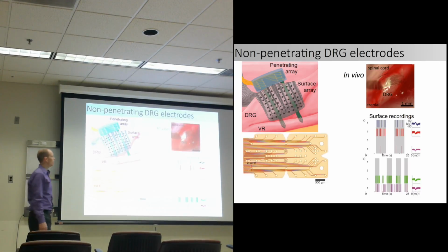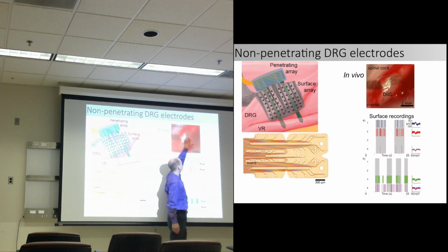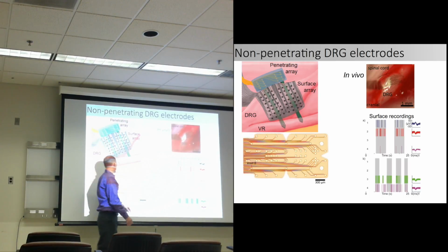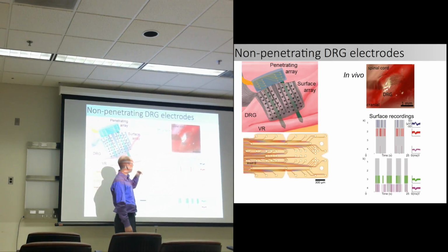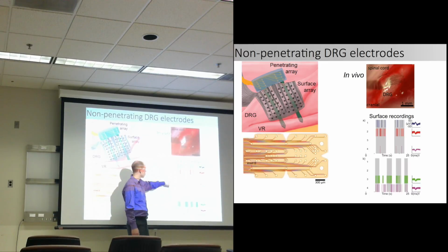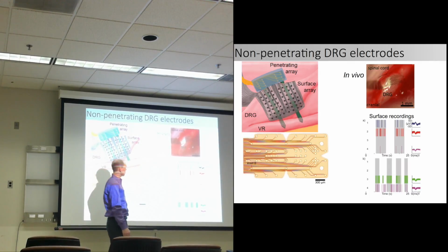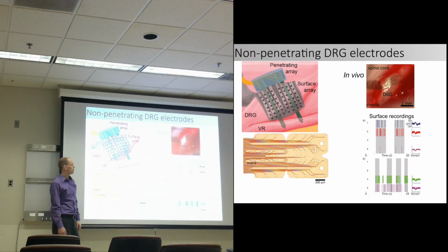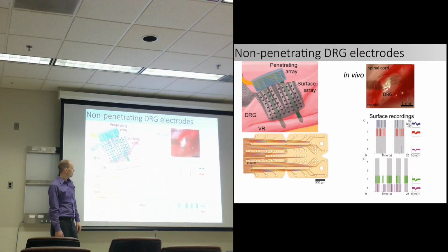So I tested this out in one experiment so far, and this is part of the electrode here. You almost see the 3x3 grid in the middle up to this part. The rest is just out of focus in the picture. And just by laying this on top of the ganglia, in this case at the lumbar level, there are single unit or clear action potentials for brushing in two different areas on the skin. So there's no downward pressure applied. So we're really excited about continuing to evaluate and modify this technology further.